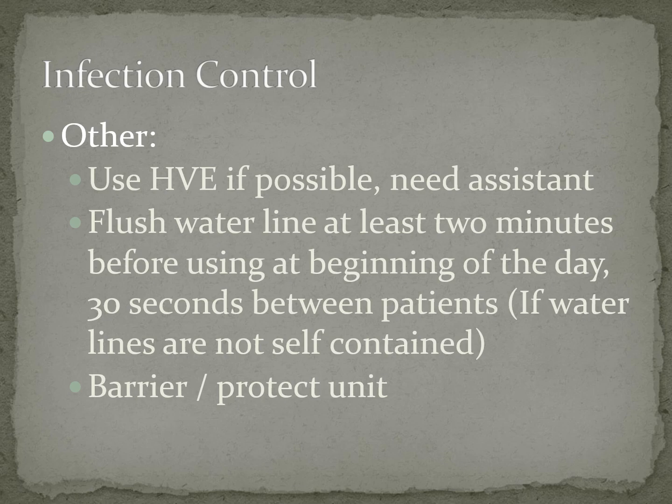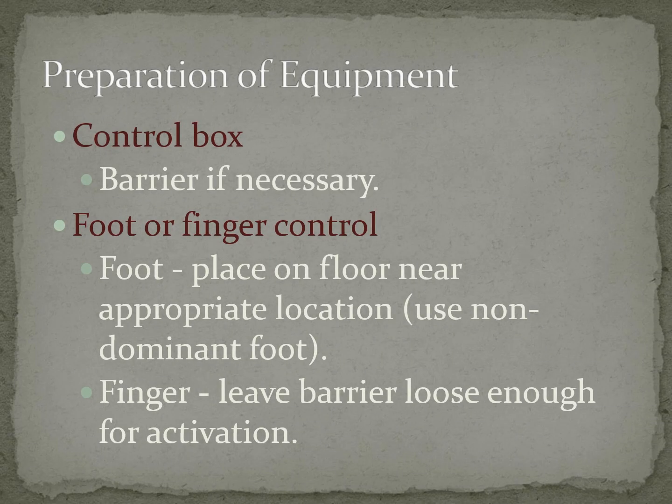Okay. We're going to go through all this in clinic too, and so you'll see how to set this up and break it down. It'll make more sense when you can see it, but I'm just going to kind of talk you through it in this lecture. So you're going to barrier the unit so it's protected. I prefer that you leave them inside the white cart. That's why the tops scroll back and forth. Barrier that control box only if you're going to leave it sit out or if you're going to be touching it. So barrier at least the power knob.